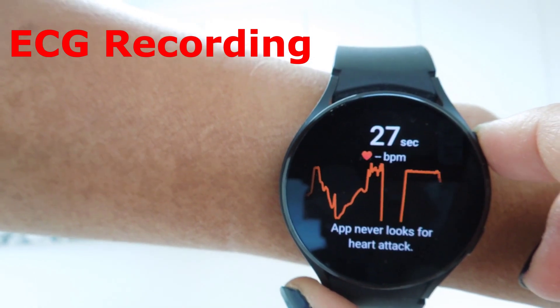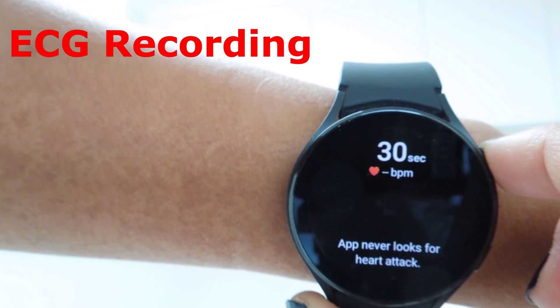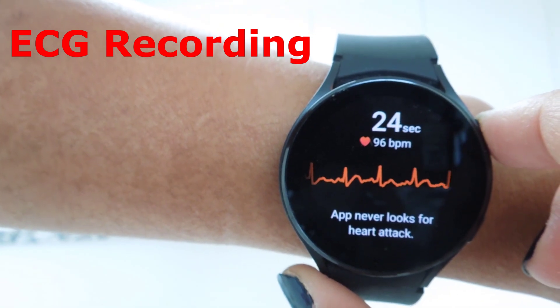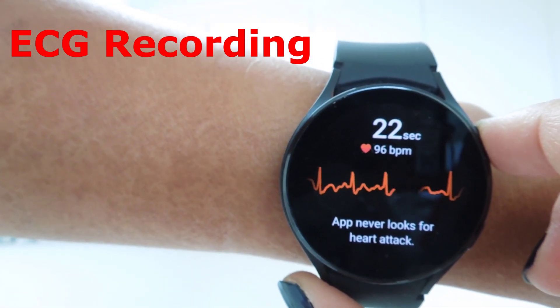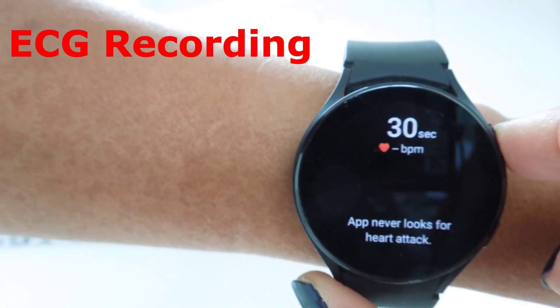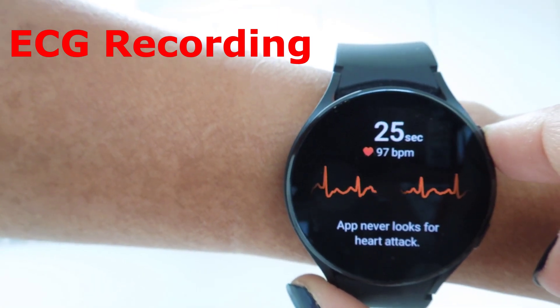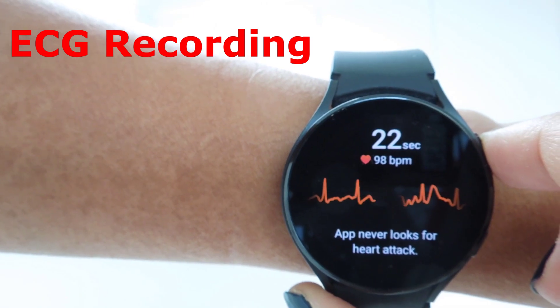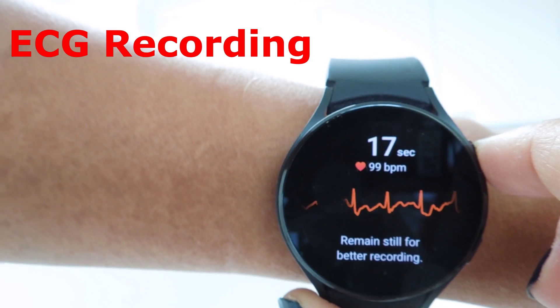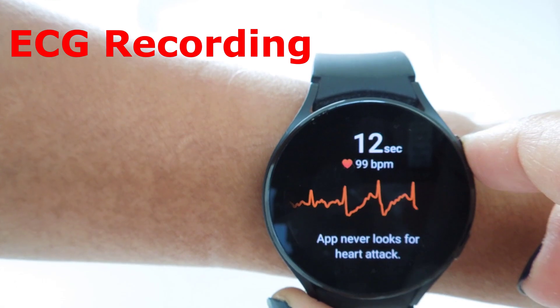I click the record button and rest my finger on the home key to start recording. The watch asks me to stay still and keep my finger on the key. It restarted from the beginning a couple of times because my hand wasn't still. To record the ECG, you must make sure your hand remains really still and that the finger on the home key is not dry — it should be well moisturized.